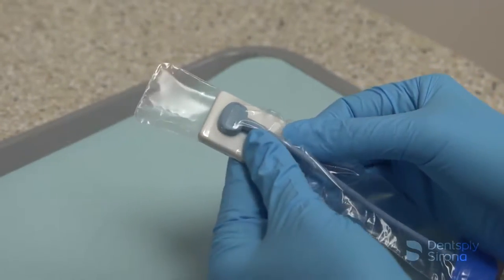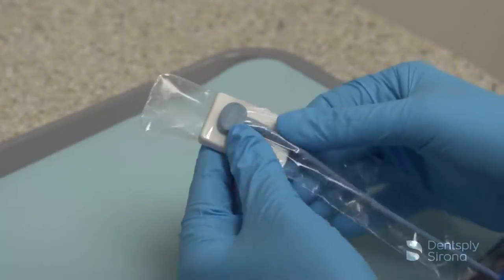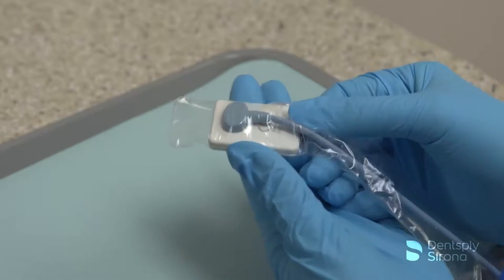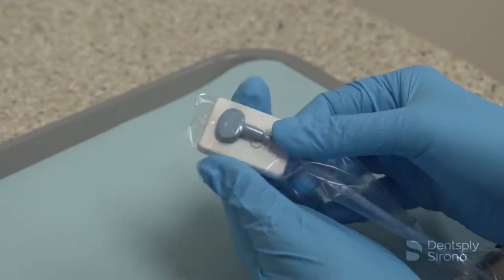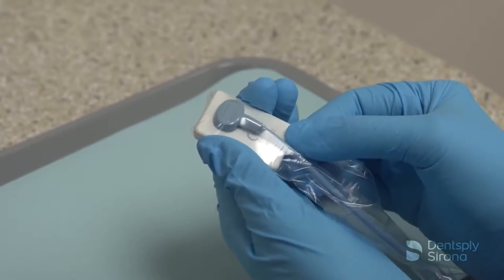When you reach the tight part of the sensor cover, hold the sensor at the bottom with one hand. With the other hand, move the sides of the cover down over the sensor. Do not push or pull on the cord to place the sensor into the sensor cover.